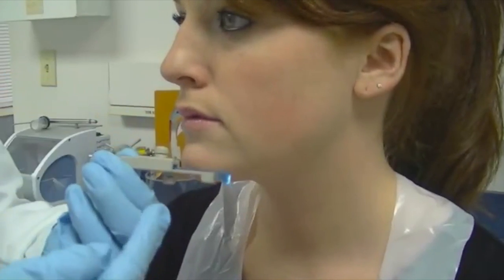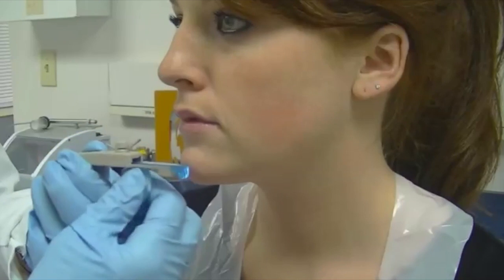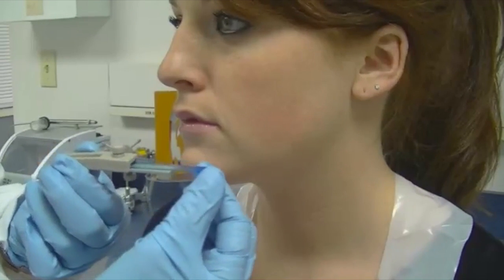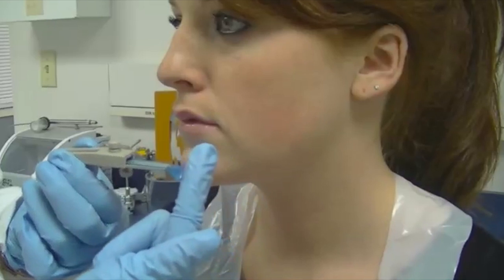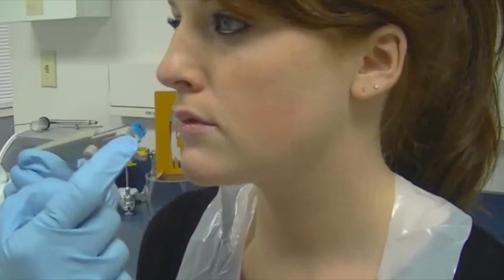The first thing you'll notice are the two set screws. On the lower, you can loosen that set screw if the patient has an extensive crown and bridge where it's a little bit thicker, or malocclusions. That will allow you to adjust so it seats comfortably on the mandibular portion.